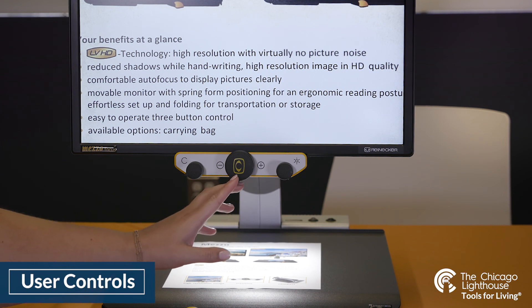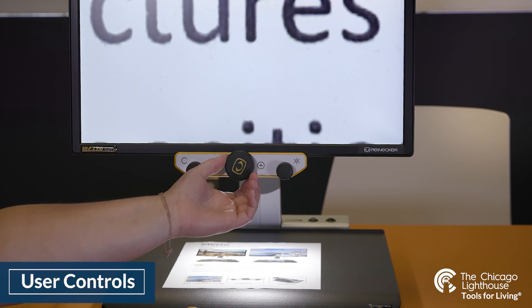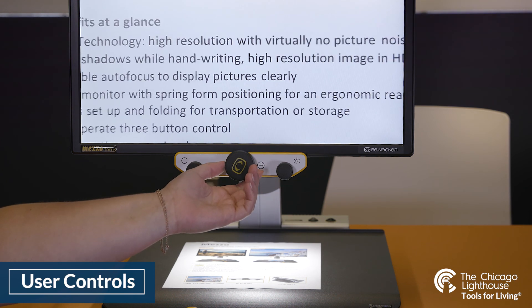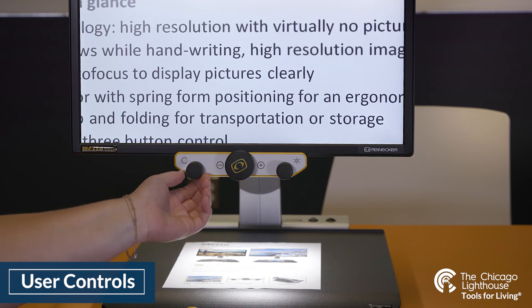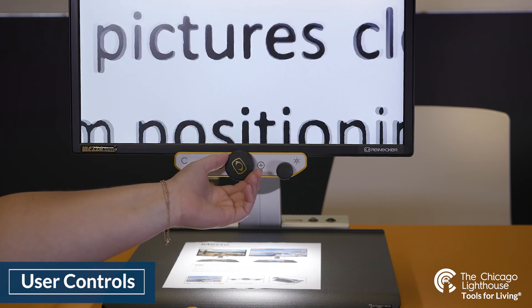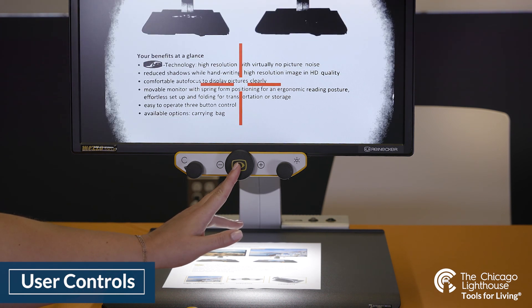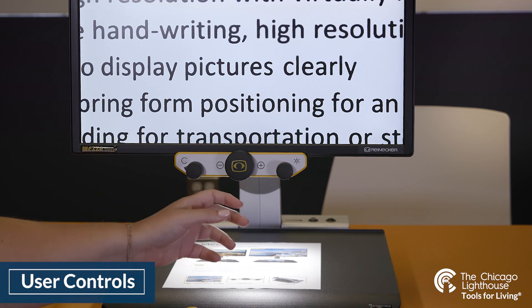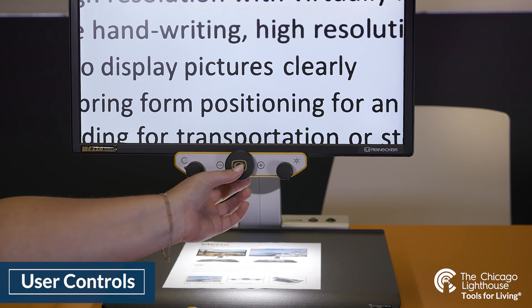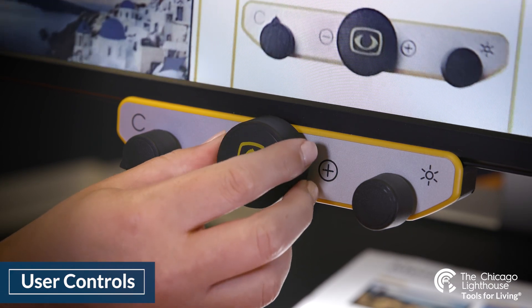The center dial controls our magnification and overview mode. By turning the dial clockwise we can zoom in to a very high level — this device can go anywhere from about one to over a hundred times zoom. When we are zoomed in, we can also use a secondary function by pushing inward and holding, which takes us into overview mode, zooming us out so we can see where we are located on the page. When we release, it will return to our original zoom level.